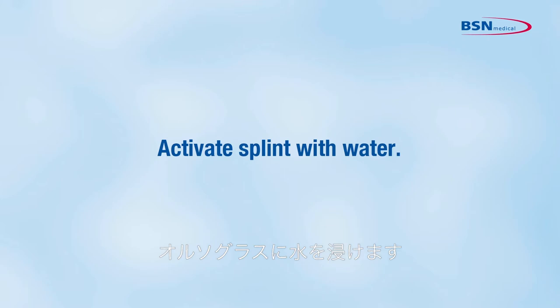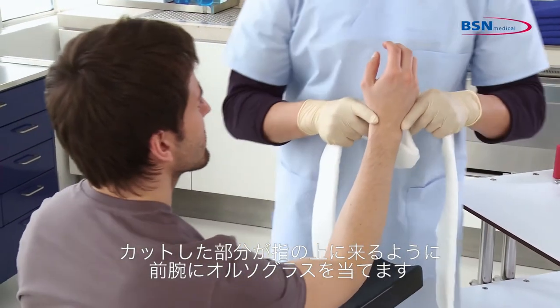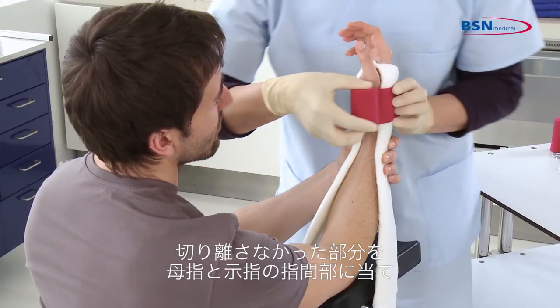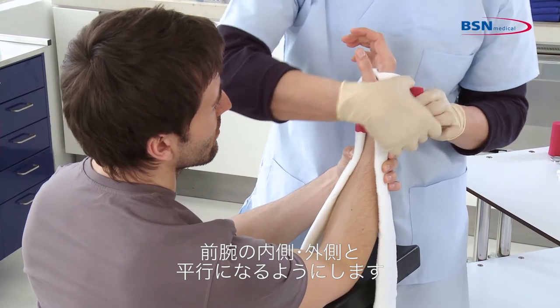Activate the splint with water. Afterwards, place the splint on the patient's arm by sliding the cut section over the fingers, with the attached section in the web space between the thumb and the forefinger. Then align the splint with the medial and lateral sides of the arm.